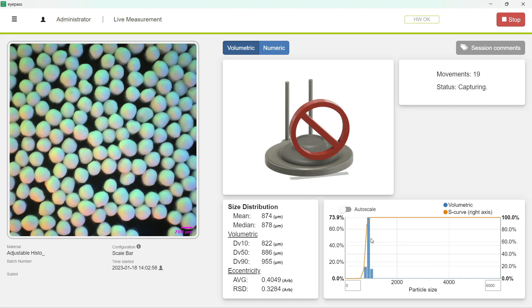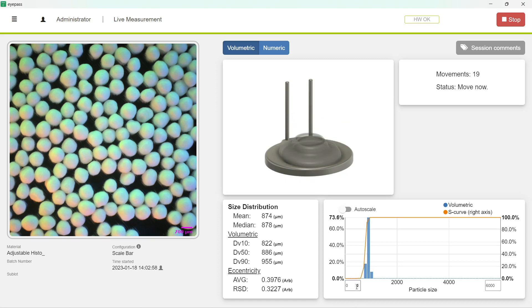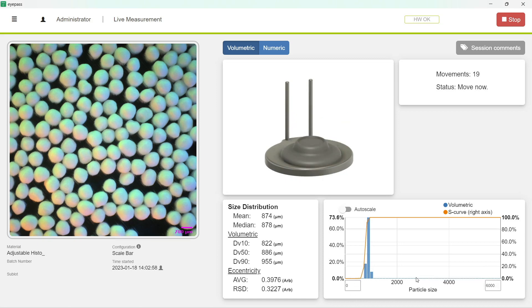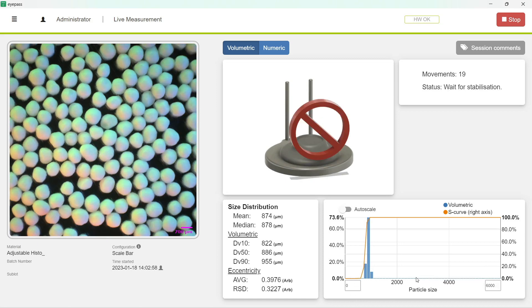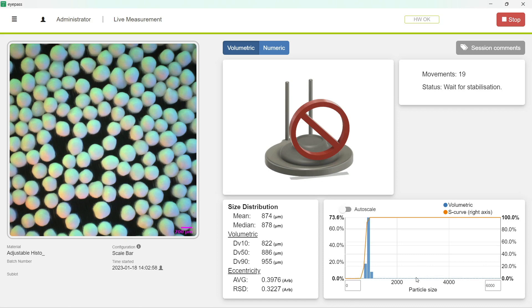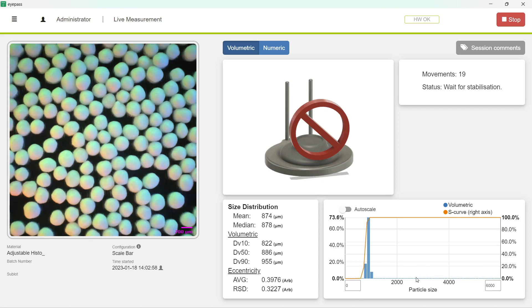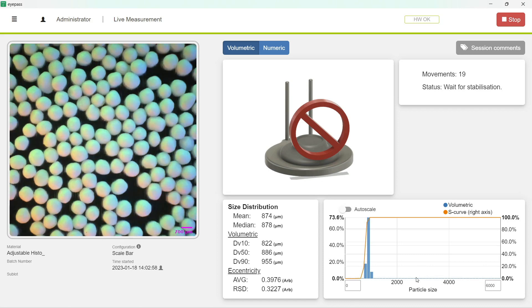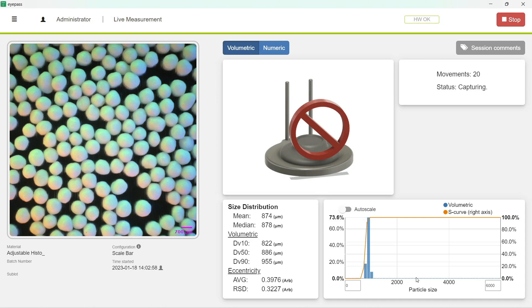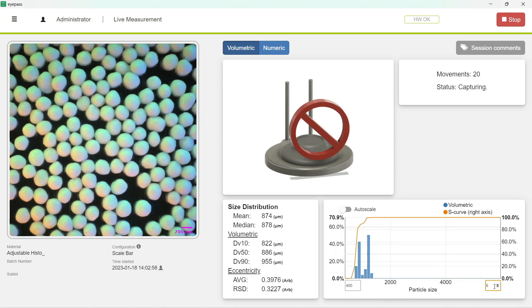So now you have the option to go from 0 to 6,000 or adjusting it to what you think your particle size may be. If I'm not mistaken, the range under the icon at the moment is roughly 700 microns, so let's go from 400 to 800, and you can also adjust it by moving the arrows up and down.